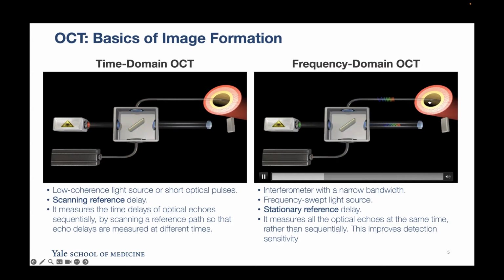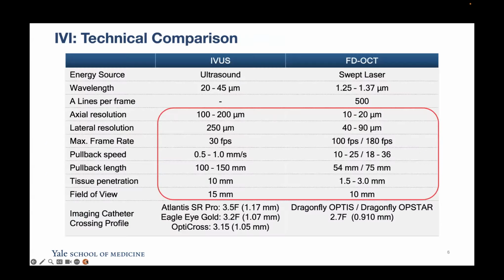So the lower the wavelength, the more you can penetrate in the vessel, and the higher, the shallower it comes. So by changing the range of the wavelength, now the mirror can be stationary, and we can get different depths in the vessel according to the laser wavelength, as opposed to having to have a mechanical movement of the mirror. So this was the trick, to have faster OCT pullbacks that allowed us to use it in clinical practice. Just a historical curiosity here.